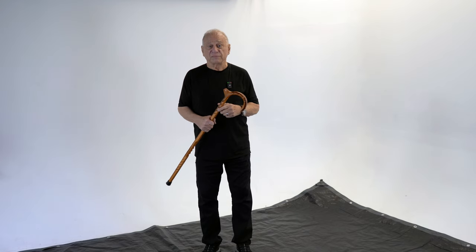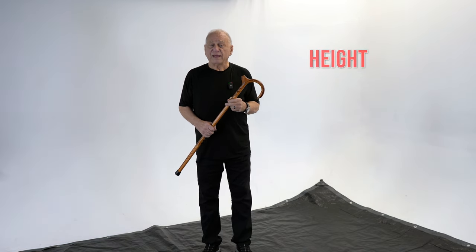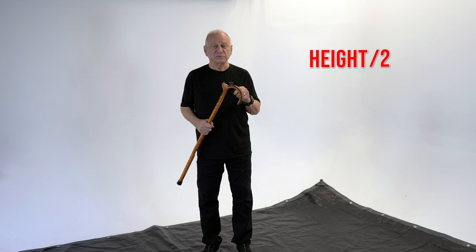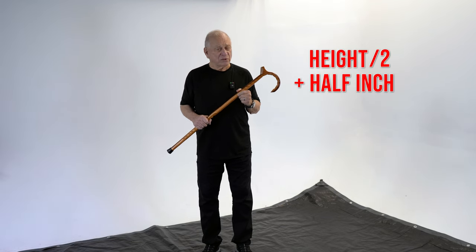There is an old rule of thumb that applies in about 99.9% of cases. If you want to know the correct height for your cane, wear the shoes you normally wear when you're out. Measure your height, take that number, divide it by two, and add a half inch. That is going to work almost all the time.